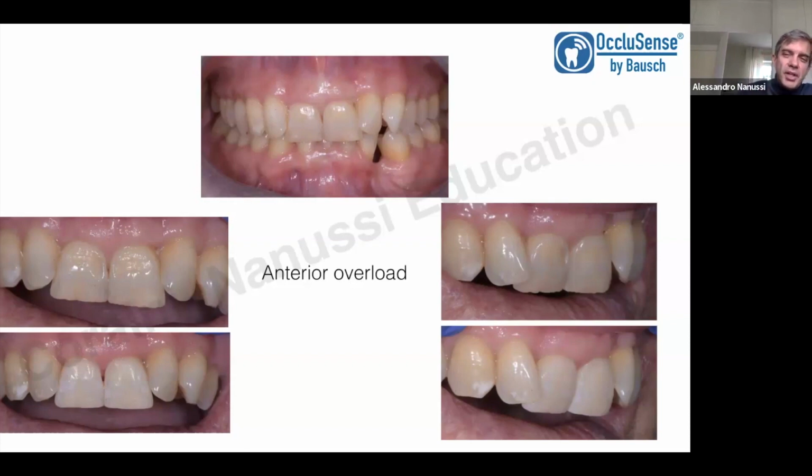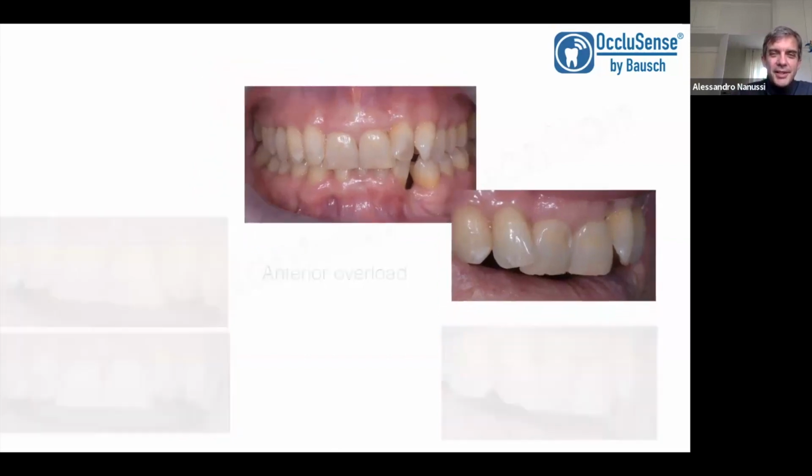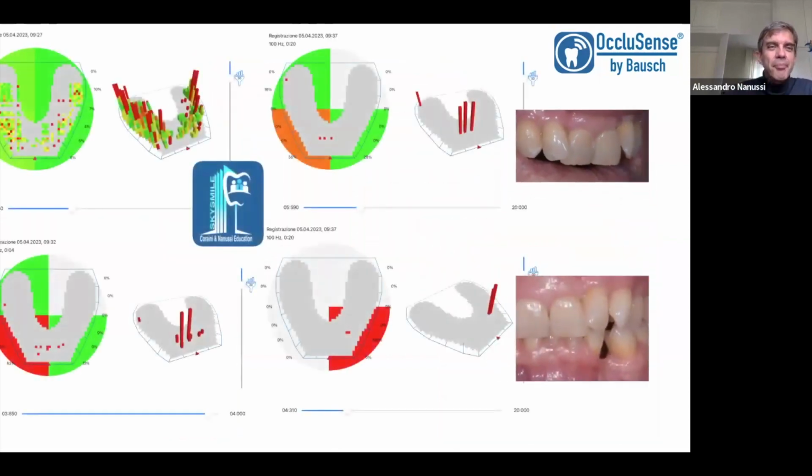Well, we can usually apply a filling and it's easy to repair this abrasion. But I think about how long it will last. I see a risk for my filling, which can be damaged from the flexion of the tooth under overload. So I want to check the load on the tooth. We can see that this patient has an orthodontic problem, obviously second class, second division, a situation that usually creates a functional envelope for the jaw, and usually creates anterior load.